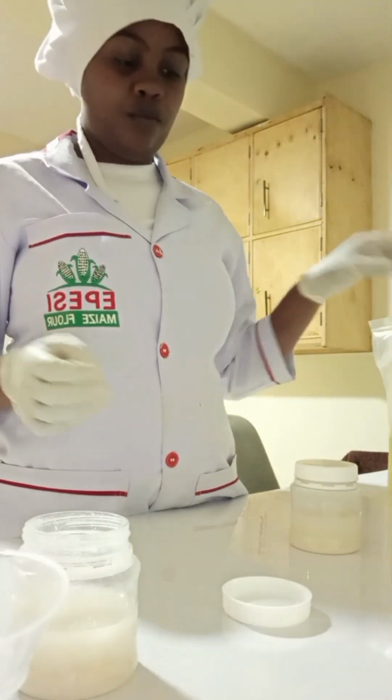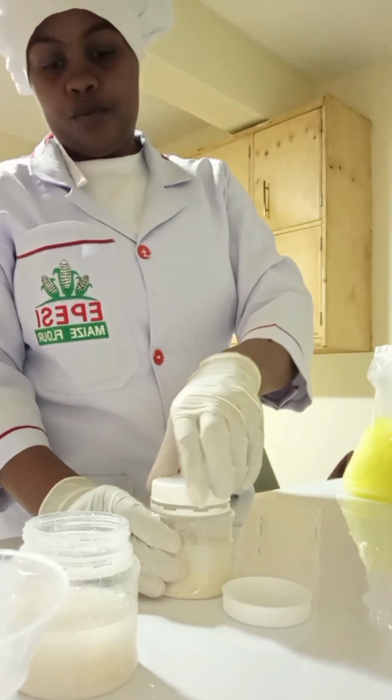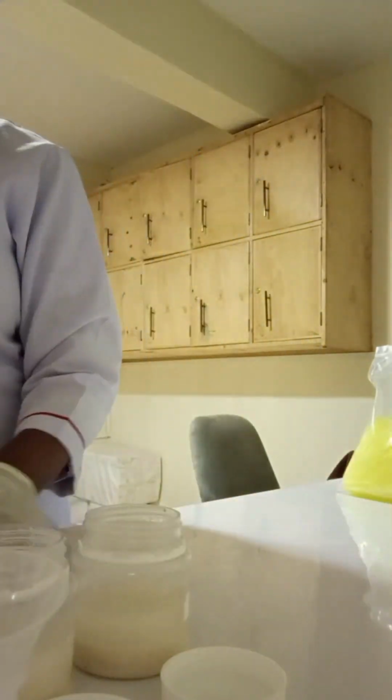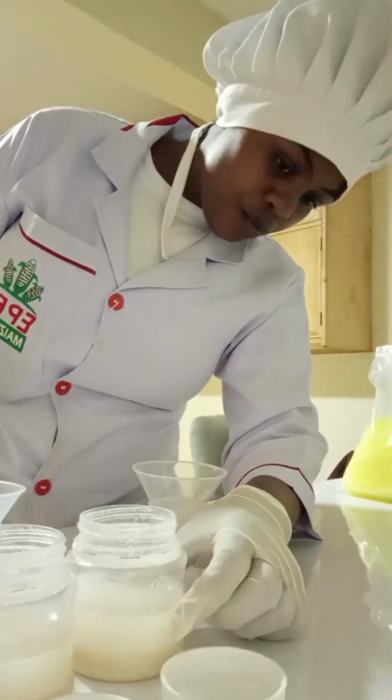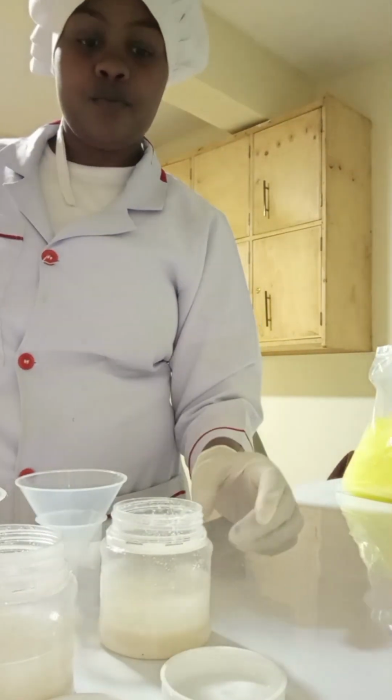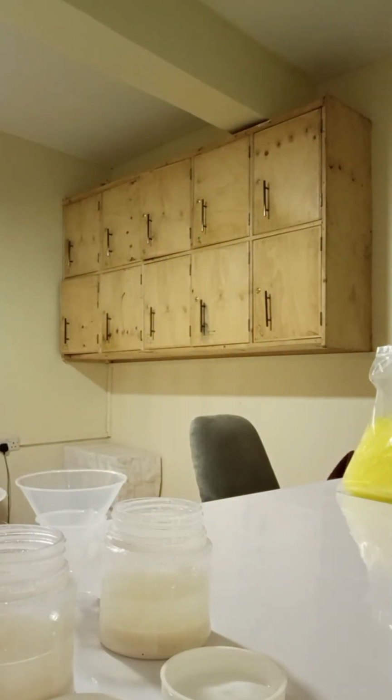When you get here, you feel you've finished the big task. Next, you leave this solution, the extracted samples, for about 1 minute so that they can settle down.